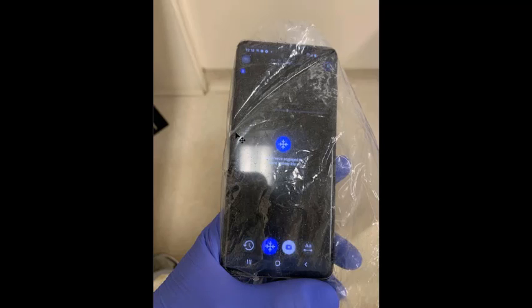One other thing to note is that before you go in the patient's room, after you've prepared the probe, you want to adjust whatever settings you can before you go into the room. You can see that it's a bit more cumbersome to use the touch screen, touch various buttons, adjust settings with a plastic wrap from the probe cover. So go ahead and adjust all the settings you can before going into the room to reduce how many times you have to adjust settings once you're in the room and scanning the patient.